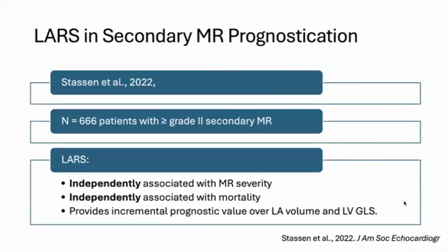So just moving on to a lesser known, maybe potential future application of left atrial reservoir strain in echo assessment, which is the assessment and prognostication of mitral regurgitation.